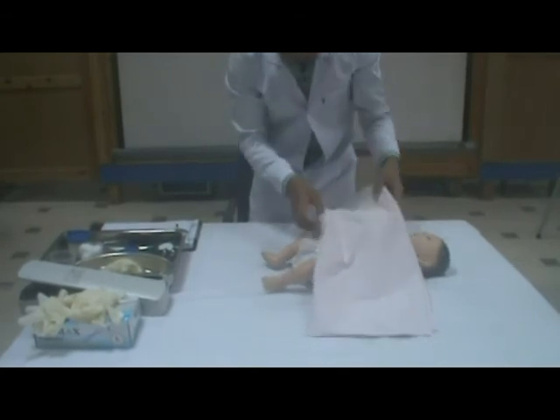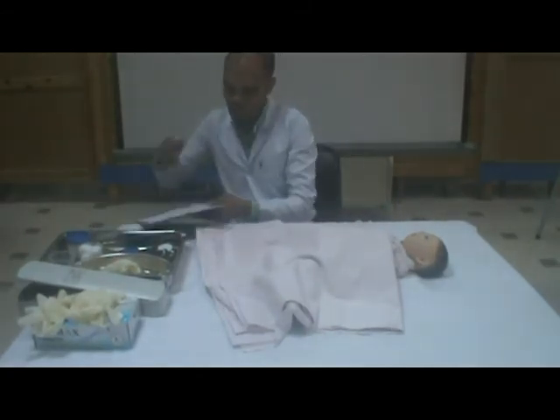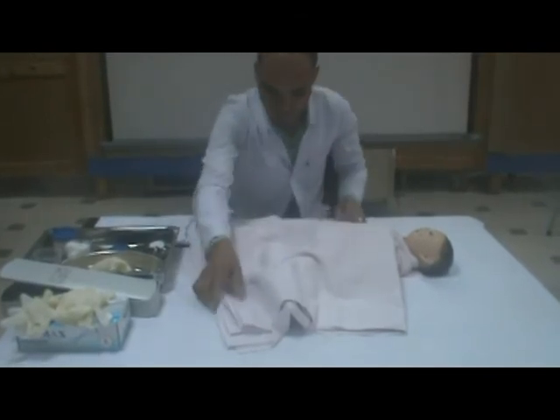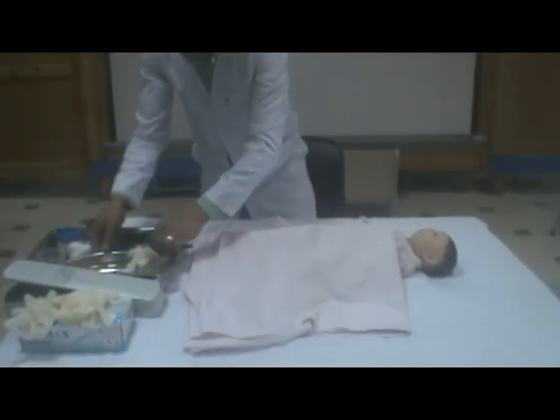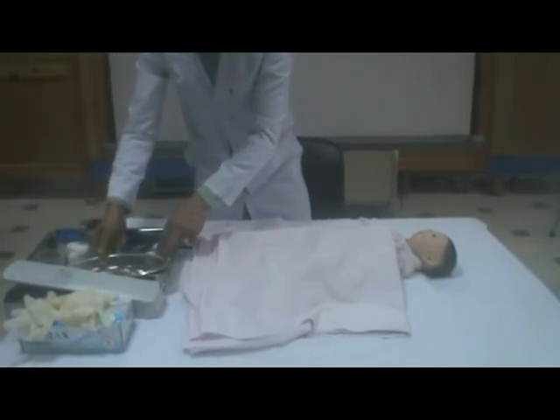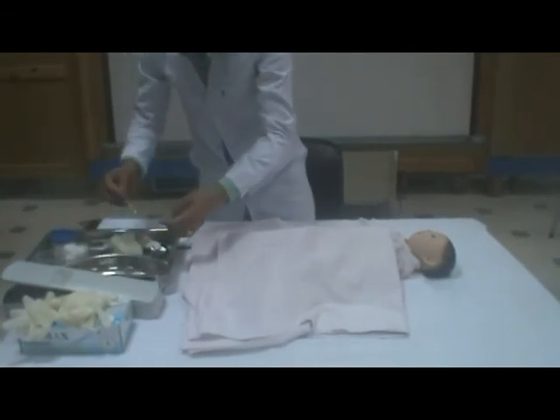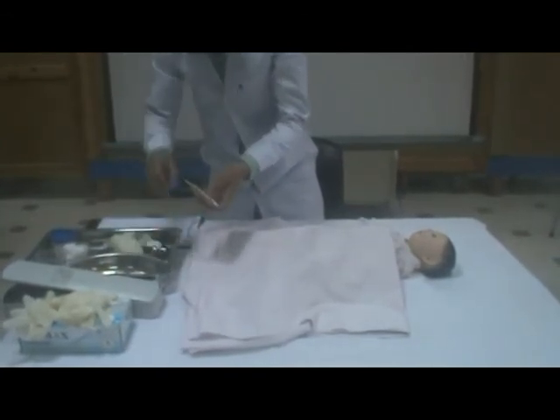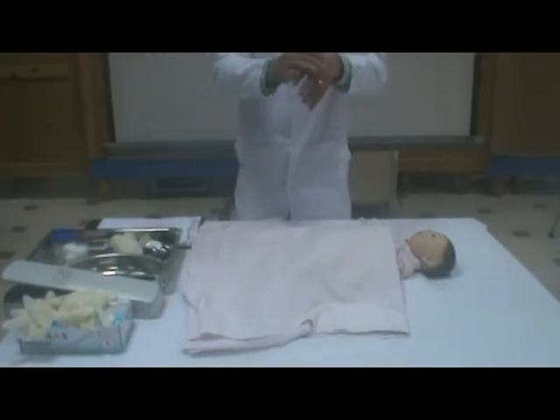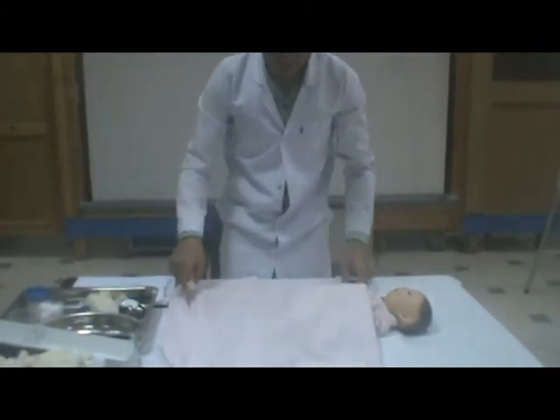Close the child. Clean the thermometer with soap and tap water. Dry it and keep it in its container. Wash hands to reduce transmission of infection. Report any abnormalities.